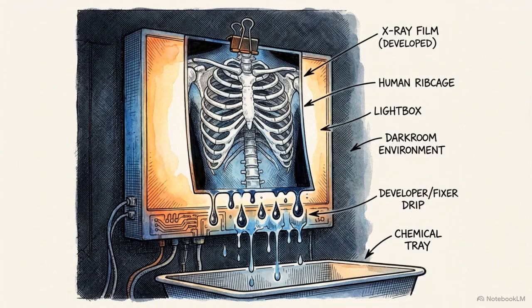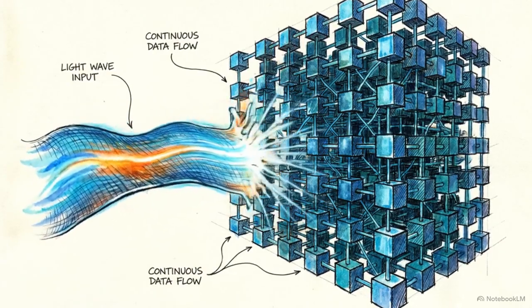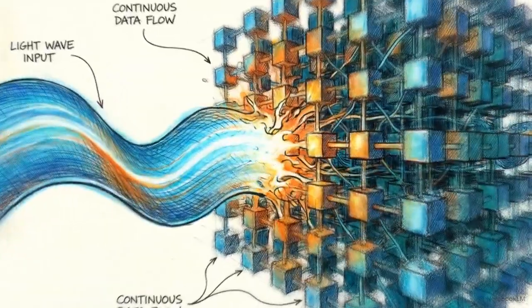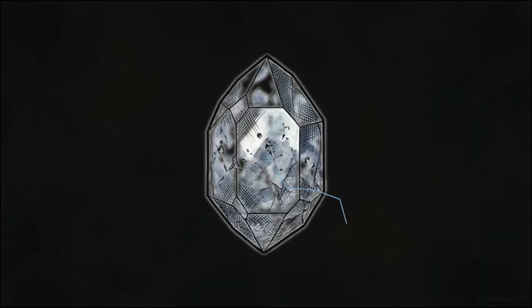Traditional screen film radiography, where a physical copy of an X-ray was chemically developed, is obsolete. Today, when incident radiation strikes a solid plane, the physical energy is instantly translated into a binary data matrix. The engineering problem governing this process is one of time. An X-ray photon is transient.